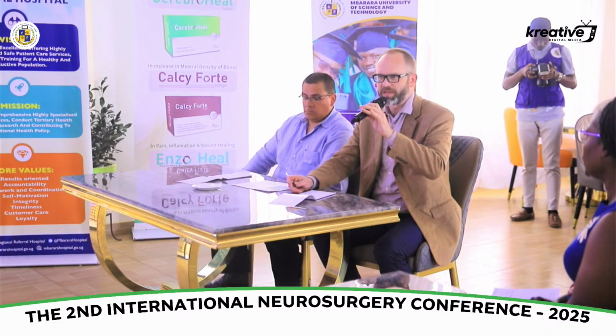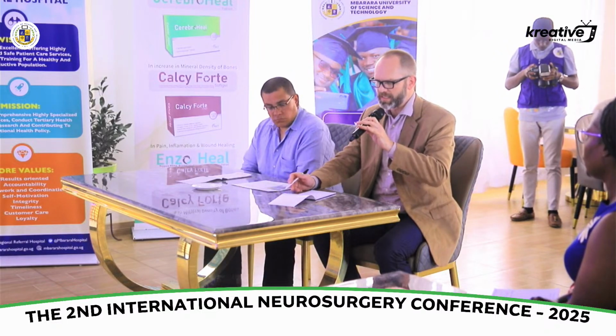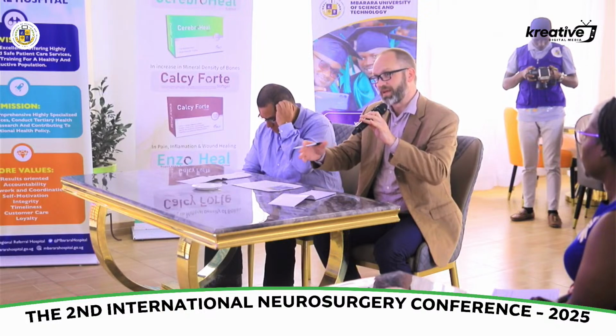There's something called ultrasound localization microscopy, which allows you to use contrast ultrasound with microbubbles. So this answers the contrast question a little bit. We do use contrast in ultrasound of the brain, similar to cardiac surgery or hepatic surgery, so that can be useful. But you have to have a special machine to be able to view that.